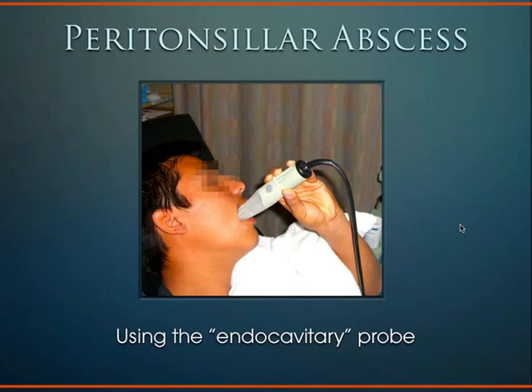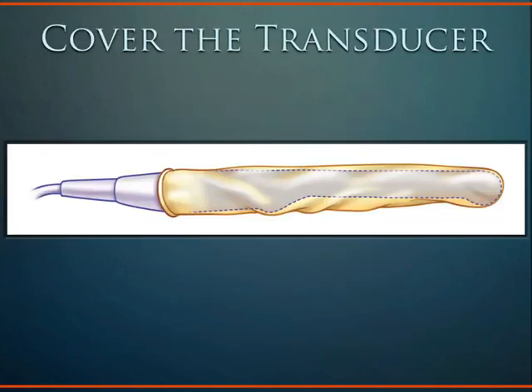There's really no good name for it. I just call it the ultrasound probe. Any other word sounds sort of suspicious. It's good to cover it with a sheath because of the other locations that the transducer can be. It's good to keep it as clean as possible using the sheath. It's good to put gel between the probe and the sheath. You could put a little gel in the sheath and then put the transducer into the sheath so there's gel between the probe and the sheath.